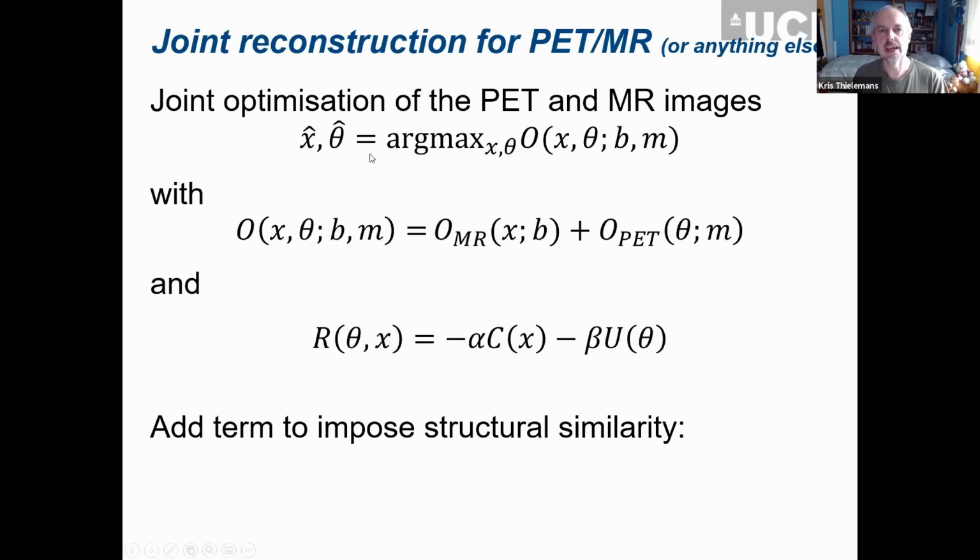If you say I have to do a reconstruction of two images, I've written it here with MR and PET just to allow you to look at the PSMR presentation that is mentioned on the HackMD website. I've just copied a few slides from there, but there is more information there. Then I've changed a few things near the end. So this would be two objective functions that you have, and you can add them together. Each of those might have a data fidelity term and a regularization term.